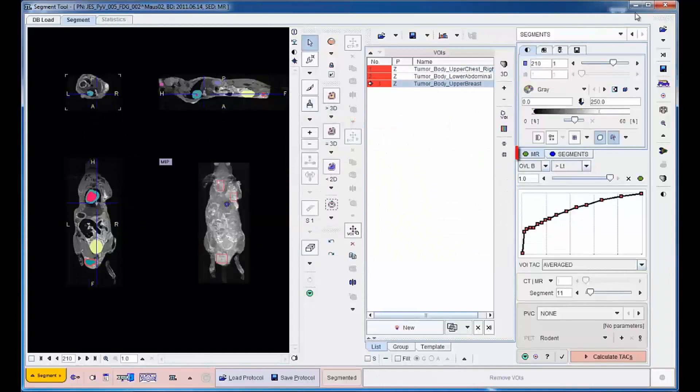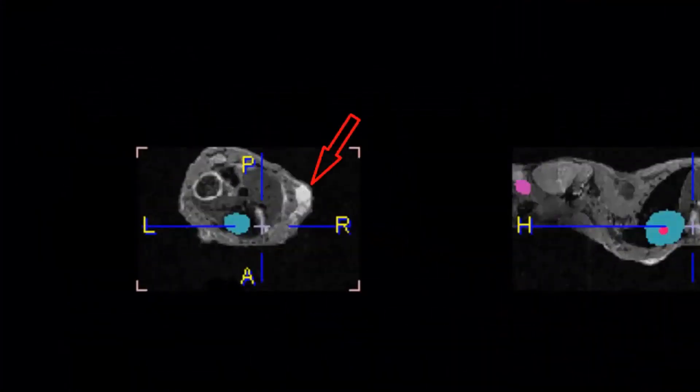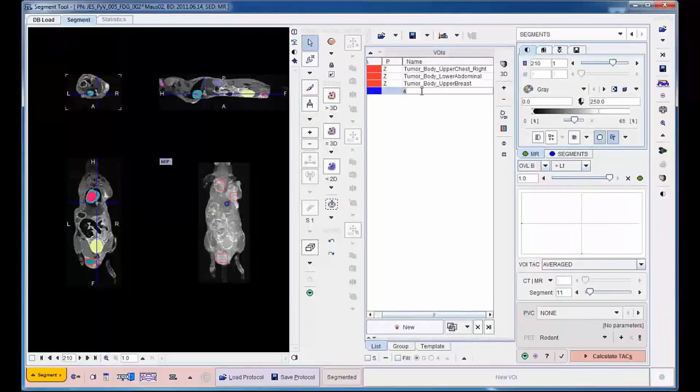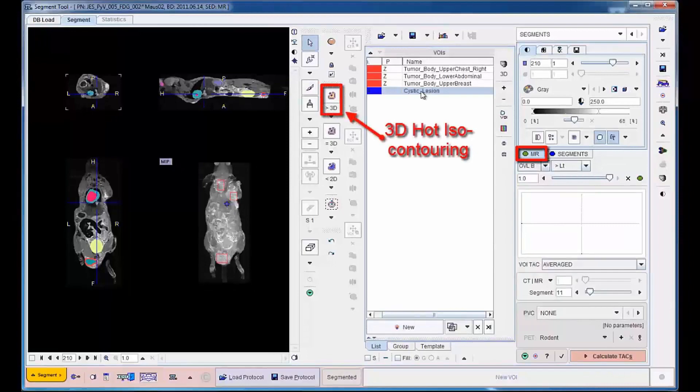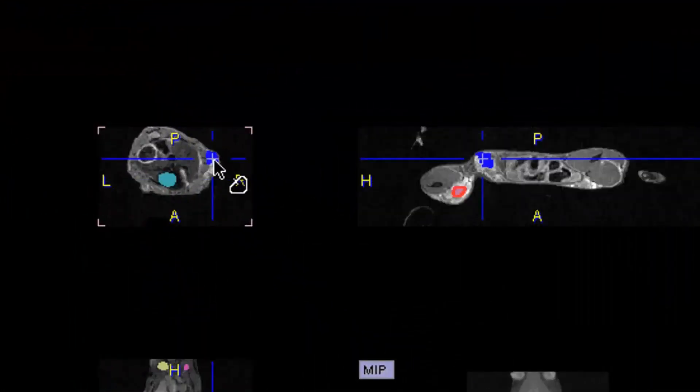One lesion is apparent in the MRI but is not detected by the segmentation. In such a situation, the VOI can be directly defined on the MR image, for instance by iso-contouring.